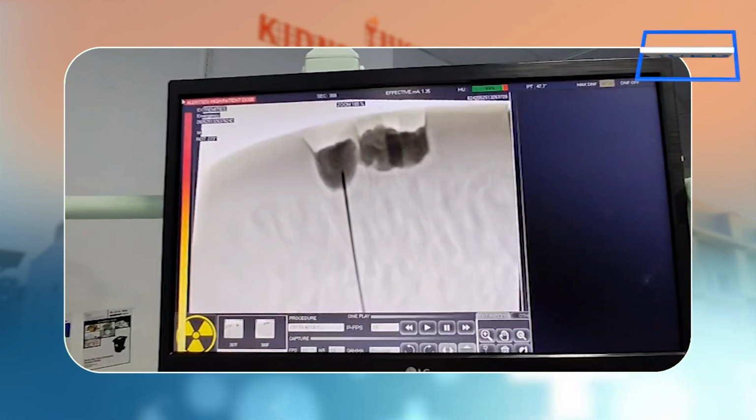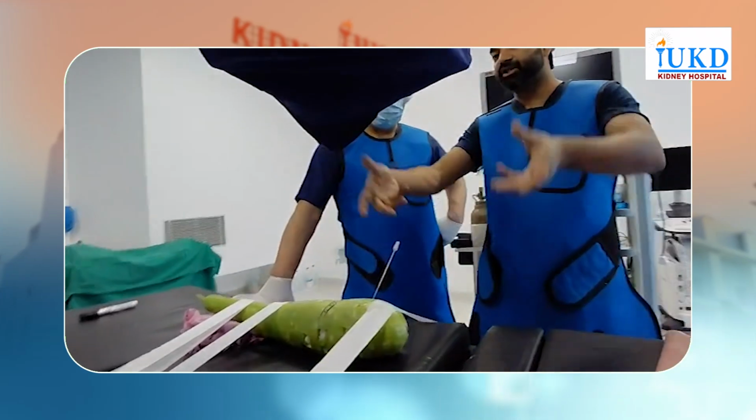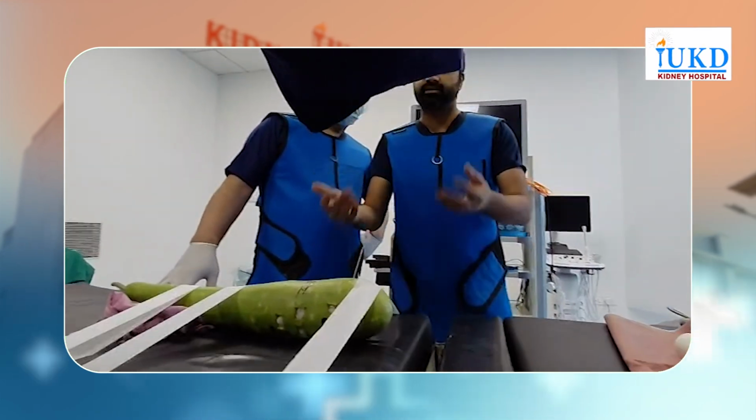Okay? So suppose I'm not sure. One thing can happen. It will be in the same display, superficial or deep. How will I check that? At 30 degrees, superficial will be needle up. Deep will be needle down. 30 degrees.